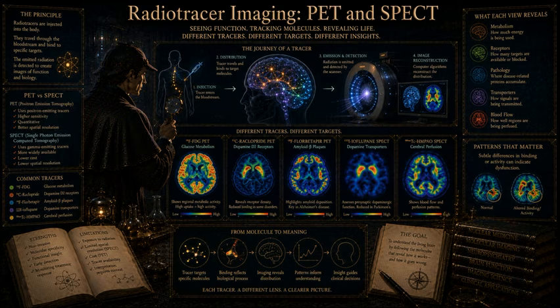But its fatal flaw is that it is incredibly sensitive to noise. The mathematics of FBP assume that the data is perfect. It does not account for the random statistical nature of radioactive decay. And that causes problems. Huge problems. Because of this, FBP often produces severe visual artifacts. Specifically, it generates streak artifacts, literal dark and light streaks radiating aggressively through the image, particularly near the edges of the skull or areas of highly contrasting activity. It can make clinical interpretation very difficult.